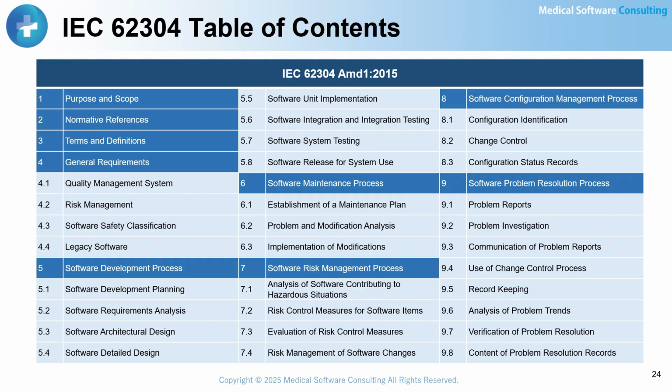This includes reporting, investigating, and communicating problems, applying change control, keeping records, analyzing trends, and verifying that problems have been properly resolved. Together, these clauses form a comprehensive framework for managing medical device software throughout its entire lifecycle.